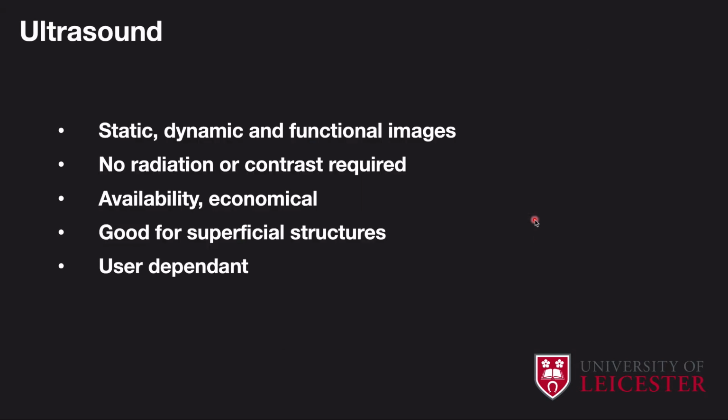We have seen some examples of ultrasound scan. To recap, ultrasound is widely used in vascular imaging. It is real-time, no radiation or contrast is needed, and is very good for superficial structures.